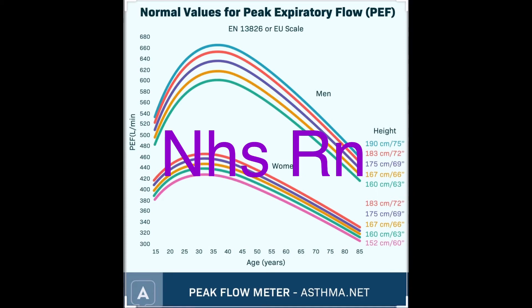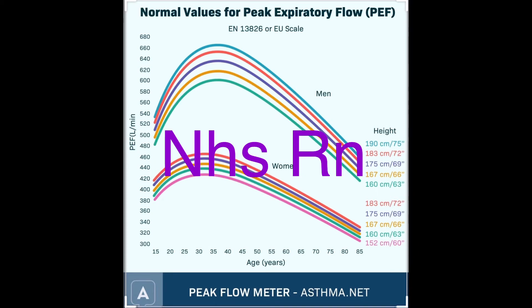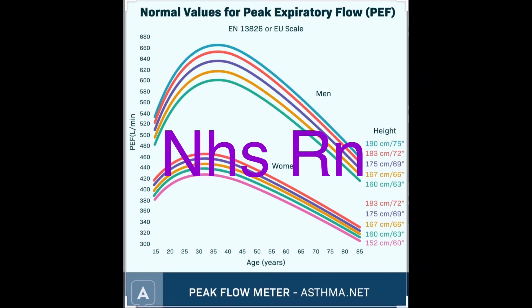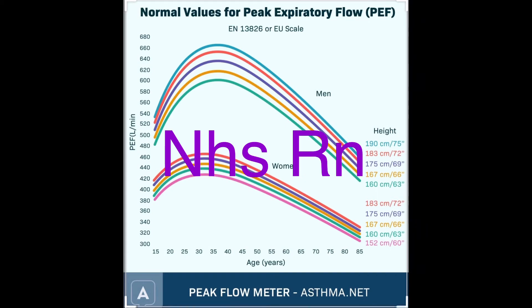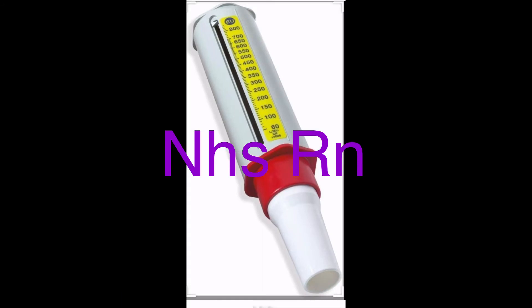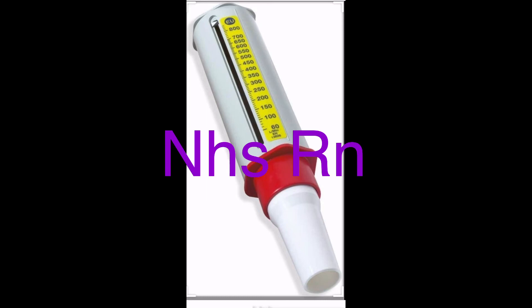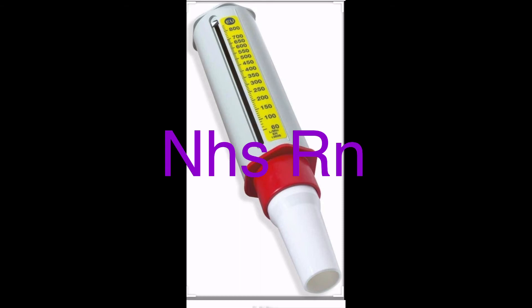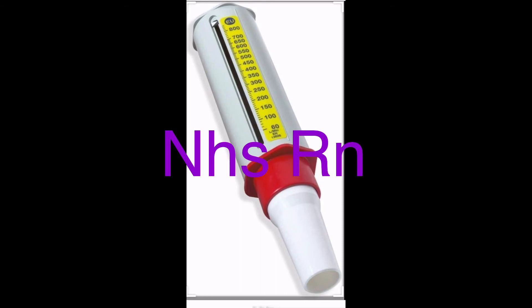The patient should perform peak flow three times a day — first thing in the morning, at lunchtime, and before bed. They should have three attempts each time and document the highest reading. Ensure the gauge is returned to zero prior to each attempt.